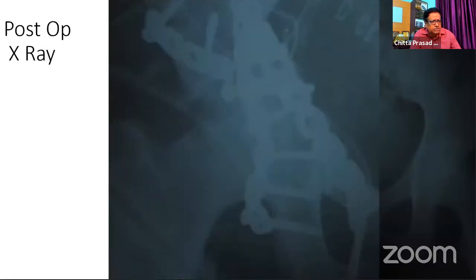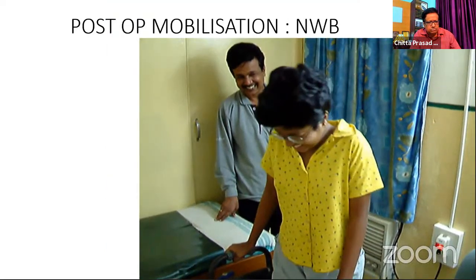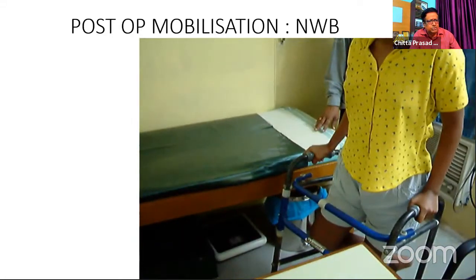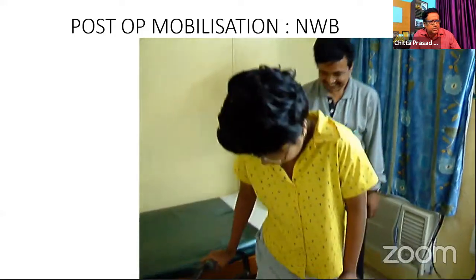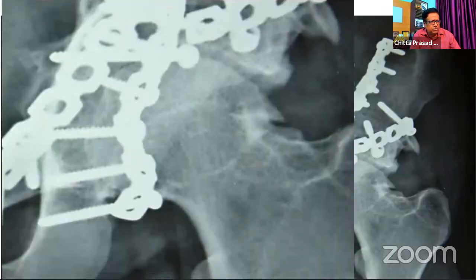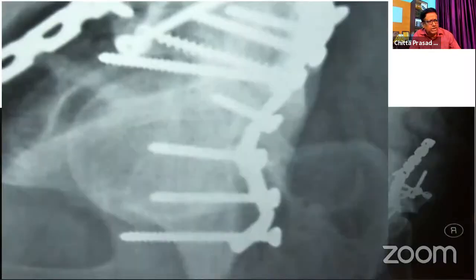So she was 13 years old, and this is the post-op X-ray. This is the magnified view of the post-op AP view. This is the articular congruity seen, and this girl started mobilizing just as she was getting discharged. This is at the end of 2 months, and the magnified Judet view again. This is at the end of 10 years. She is showing some signs of sclerosis, but no reduction in the joint space. And this is a Judet view, and this is a magnified Judet view.